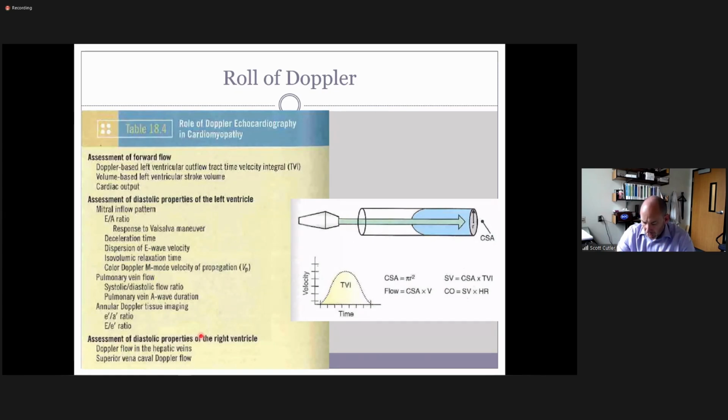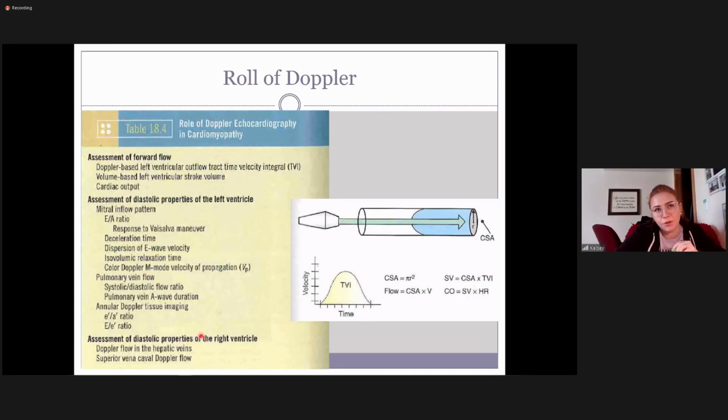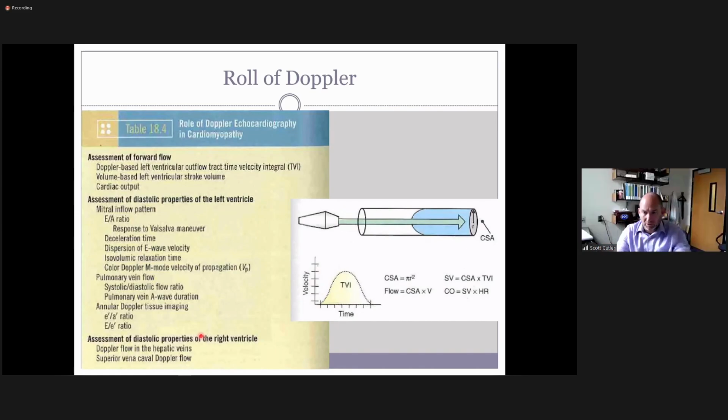And as a quick review, also in diastolic function, what are the grades of diastolic dysfunction, first of all? So there's impaired relaxation, pseudo-normal, reversible restrictive, and then irreversible restrictive. Yes. So irreversible is definitely the last, end of the line kind of deal. But yes, and then we also could characterize those as grade 1, grade 2, grade 3, 3A, 3B. Some places may go grade 3 and grade 4, depending on how they want to say it. But again, that's kind of what we're looking at for the diastolic function. And what does diastolic dysfunction tell us about the walls?